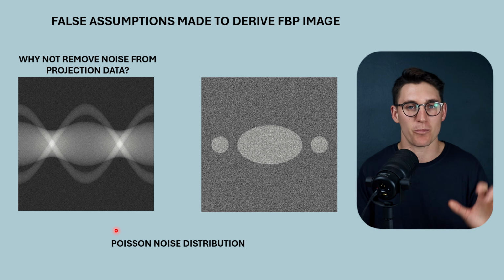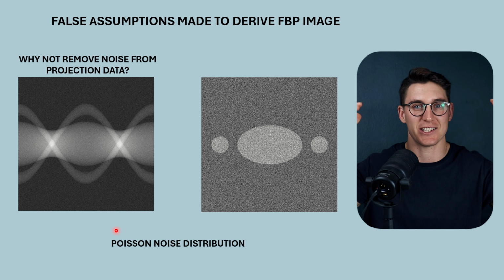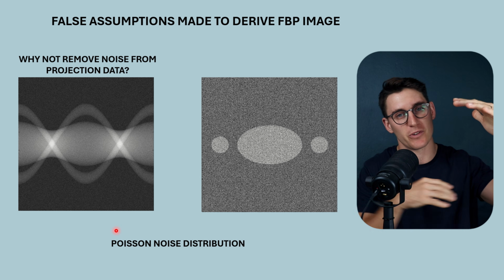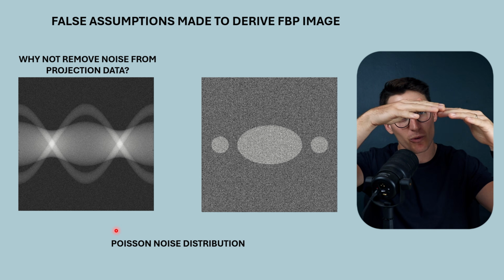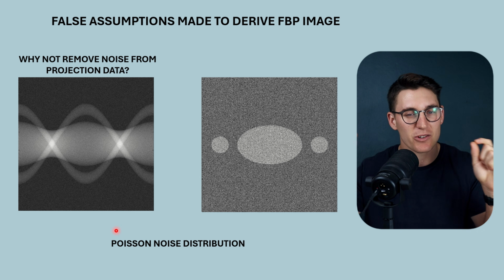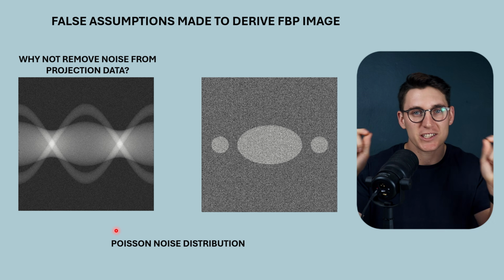Now, the way I like to think of Poisson noise versus Gaussian noise, if you're in a house like mine that has a tin roof, actually over my bedroom, I've got a tree that's over the tin roof. And when it rains very lightly, rain hits the tree and some of the rain falls through the tree. And if I'm listening to the raindrops hitting the roof at very low doses, at very light rain, that noise is quite random.